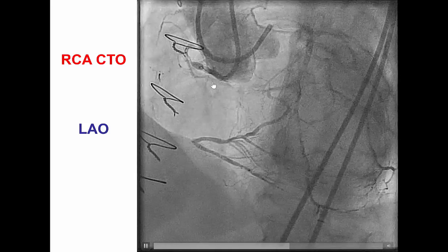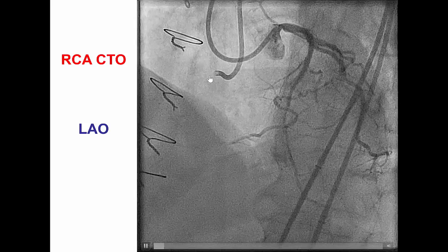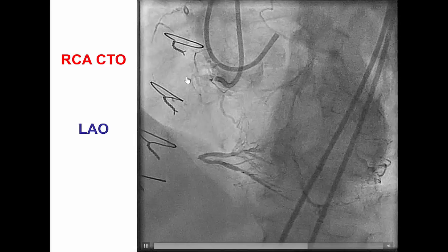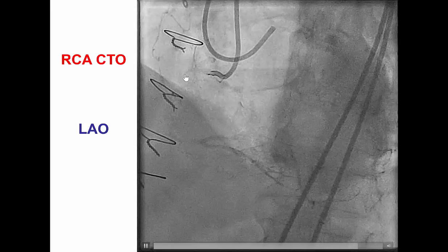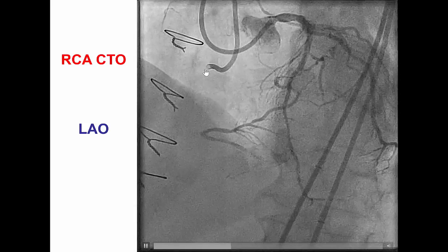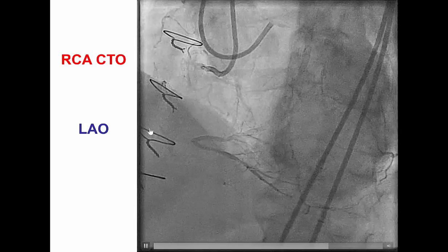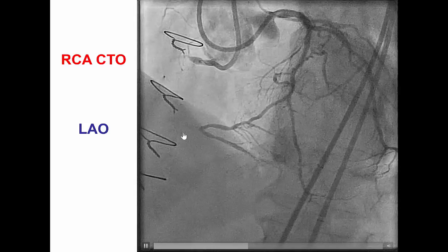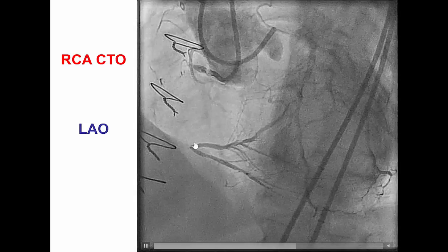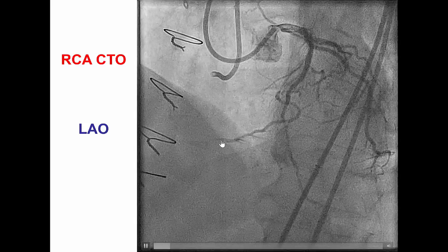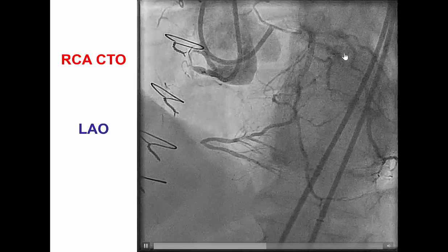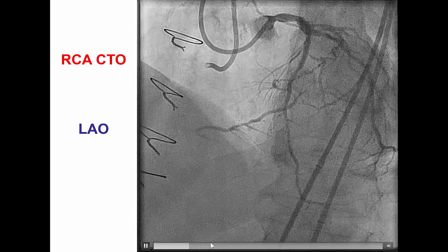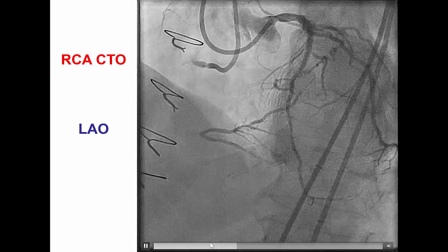The patient had an occlusion of the proximal right coronary artery with a clear proximal cap, although there were some small branches originating at the proximal cap, a very long occlusion length close to 90 to 100 millimeters, a bifurcation of the distal cap, and collaterals coming mainly from the circumflex — epicardial — and also some septal collaterals as well.